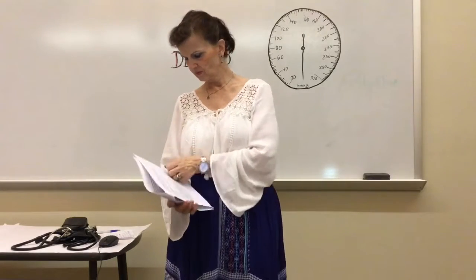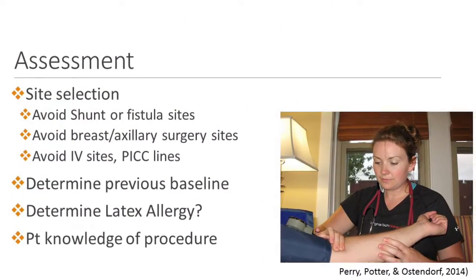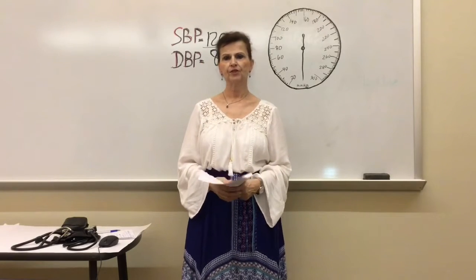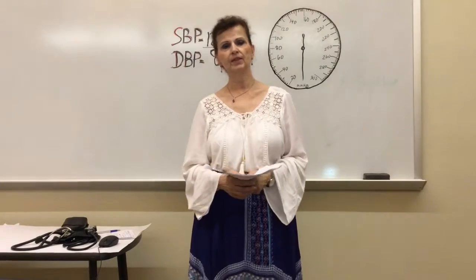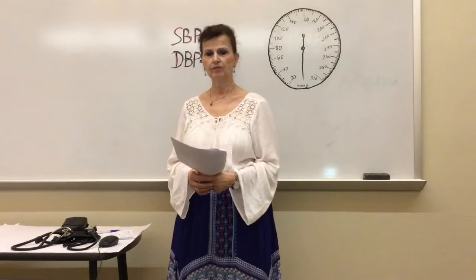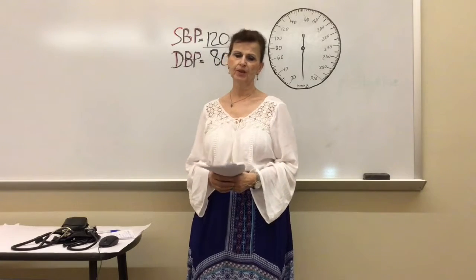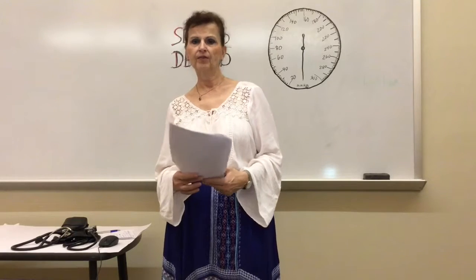Assessment. You will start with your assessment. Site selection: avoid any shunts or fistula sites. Avoid a mastectomy on that side of the body and any axillary surgery. Avoid any traumatized limb or heavy bandages.